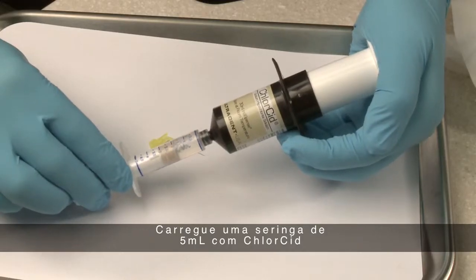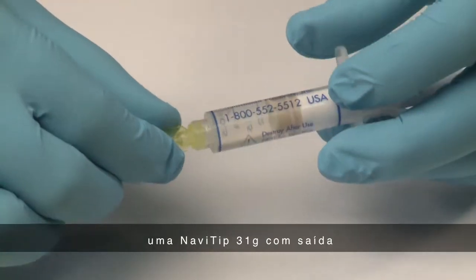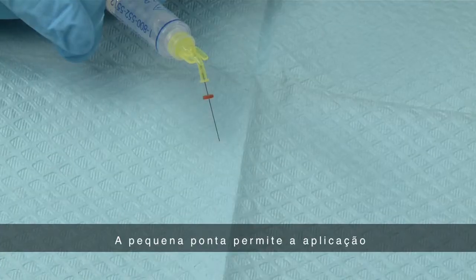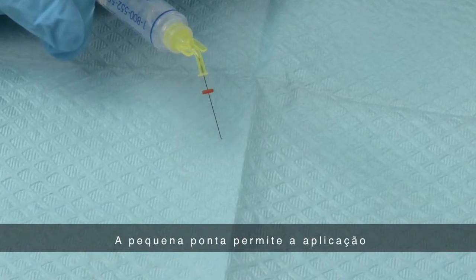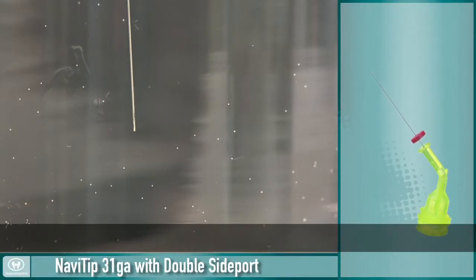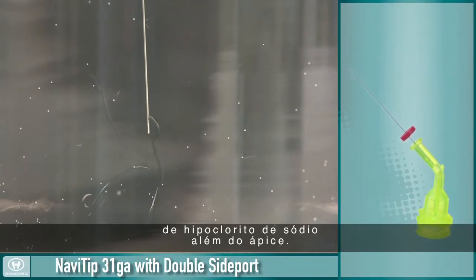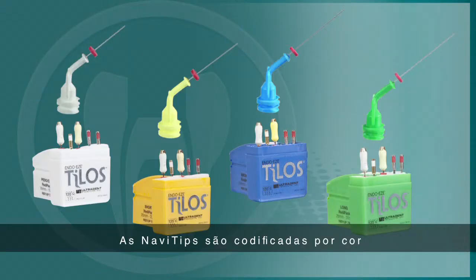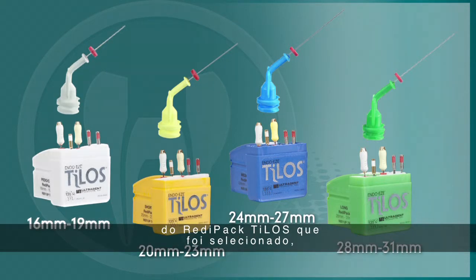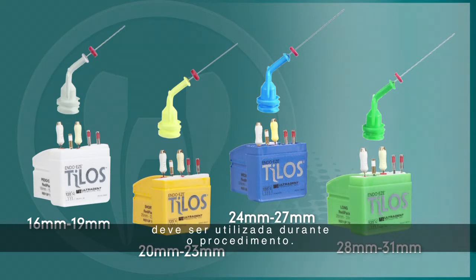Load a 5-milliliter syringe with ChlorCid, 3% sodium hypochlorite, and place a 31-gauge Navi tip with double side port on that syringe. This tip's small size allows for delivery into intricate canal spaces, while the closed end and double side ports minimize the risk of expressing sodium hypochlorite beyond the apex. The Navi tips are color-coded to match their length to the TiLOS RediPack selected, so it is easy to know which tip to use during the procedure.